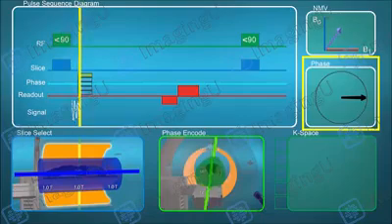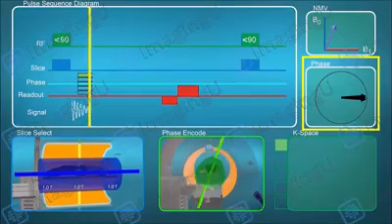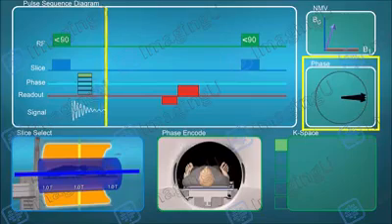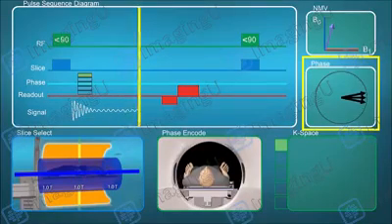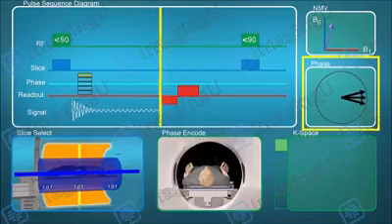The protons will begin to lose energy and dephase after the RF excitation pulse is turned off. The spin-spin interaction, or dephasing, is controlled by T2 and T2 star and results in the loss of transverse magnetization and the MRI signal. As the protons lose this coherence and dephase, the MRI signal is reduced because not all of the protons are pointing in the same direction.